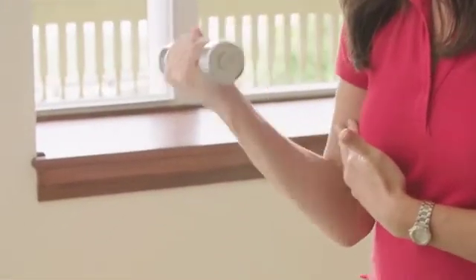Let's see the Breather in action. Watch me show Wendy how to use the Breather now. Today we're going to get started with respiratory muscle training. It's very similar to strength training you may have done at the gym. For example, if I move my arm like this, I'm using these muscles, exercising them. If I add weight and do that same exercise, those muscles have to work even harder — this is an example of resistance exercise. The Breather device allows us a complete resistance exercise for the muscles of respiration. You'll notice the numbers on the sides of the Breather; these dials control the level of resistance you will breathe in and out against. Listen for the wind sound as I breathe in and out through the Breather against resistance.